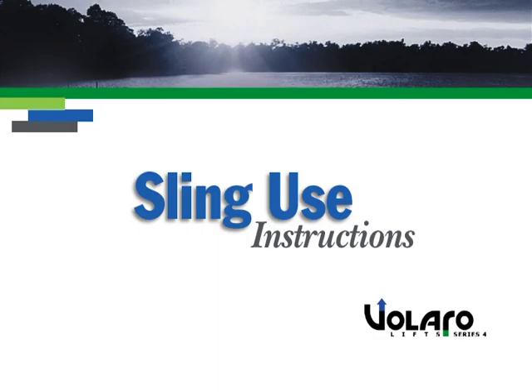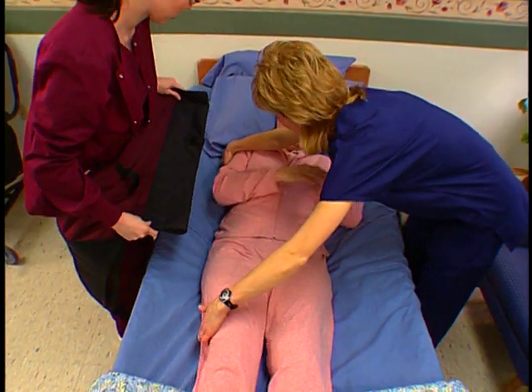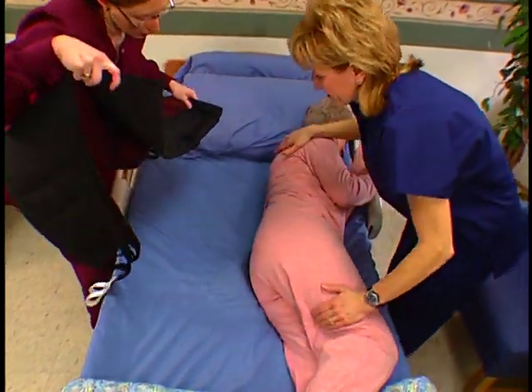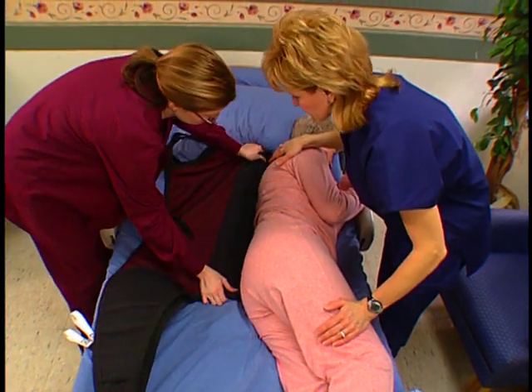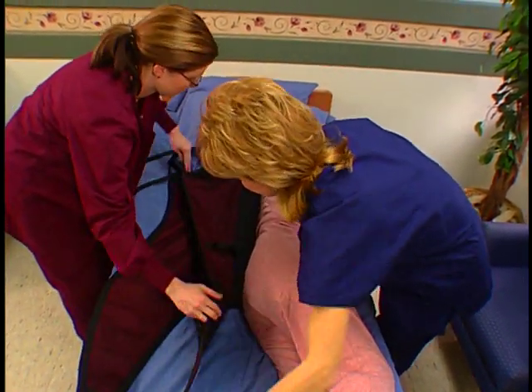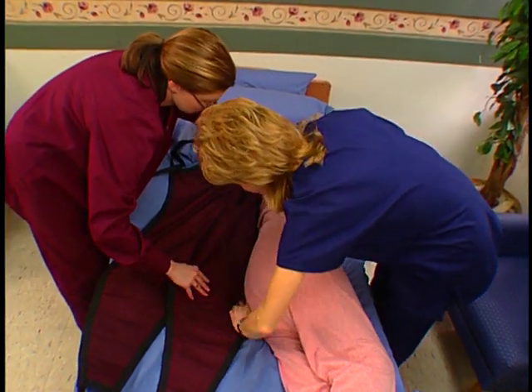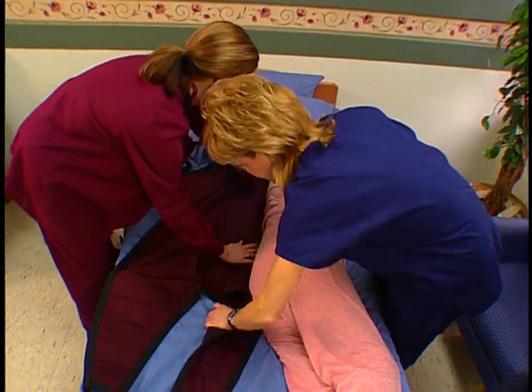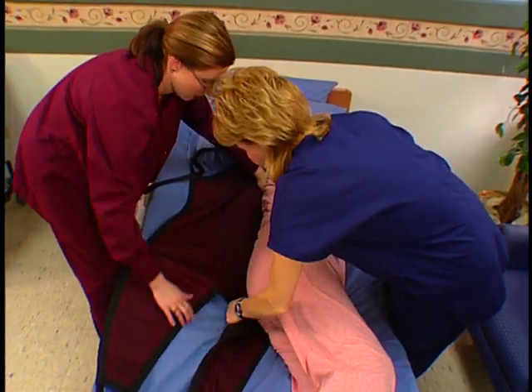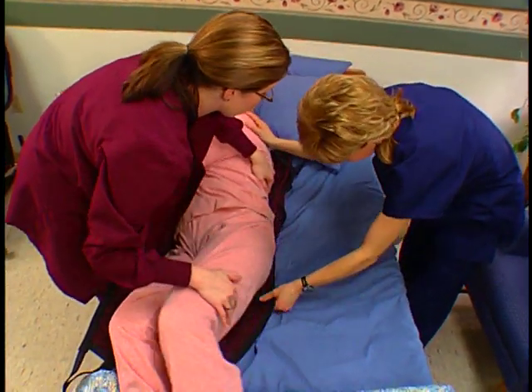Sling use instructions. Instructions for placing and removing the divided leg sling with resident on a flat surface. After completing your safety and sizing checks, fold the sling in half and roll the person on one side. Lay the folded sling along the backbone of the resident, positioning it so the bottom of the sling is centered at the patient's tailbone. Overlap the top layer and tuck the sling close to the body so it will be accessible when the resident rolls back.